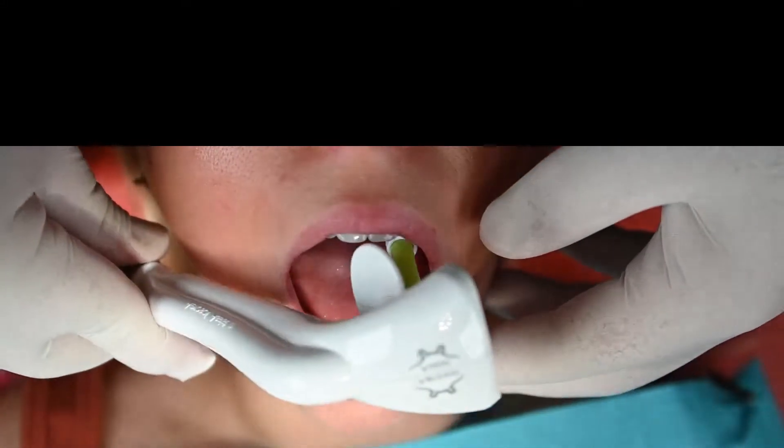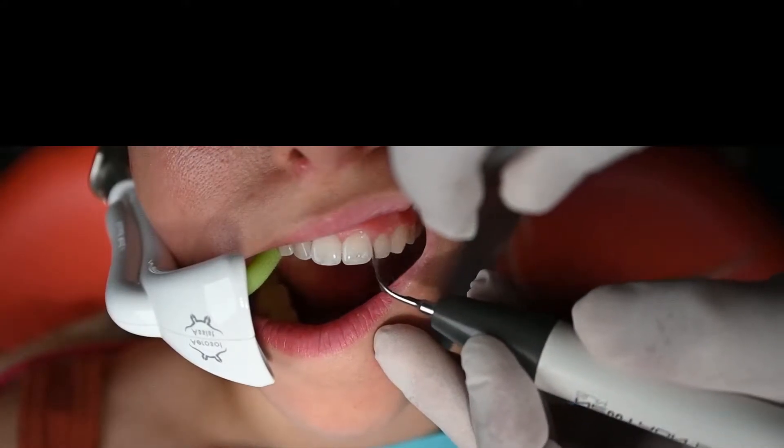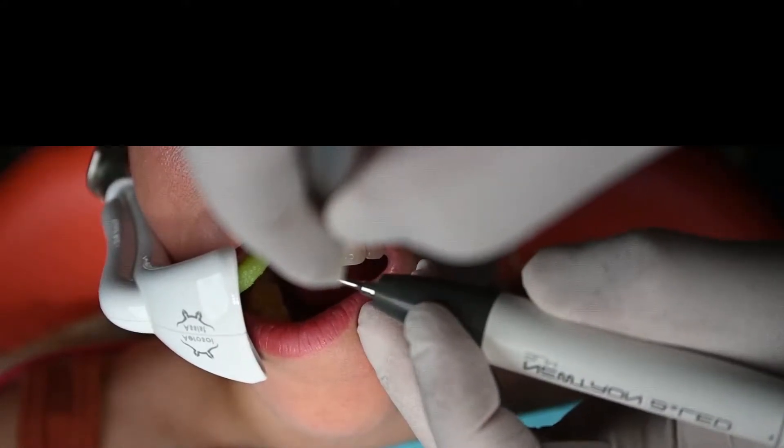In this video, we are going to see a gingivoplasty. Gingivoplasty is a surgical procedure that is simple but can provide dramatic results. Even if a patient's oral hygiene is good, the first step is to make sure we have a clean surgical environment.